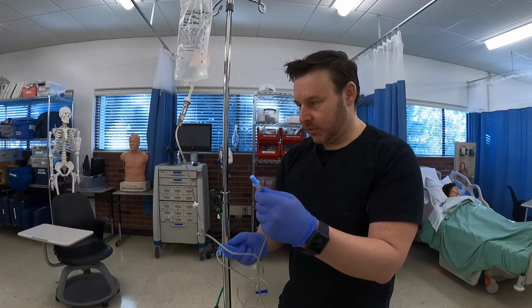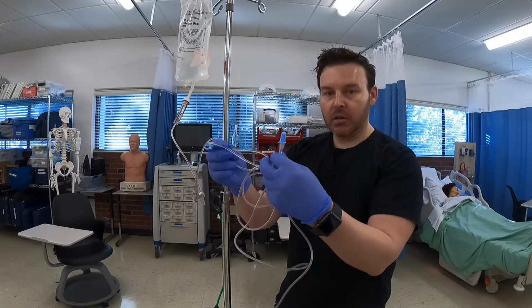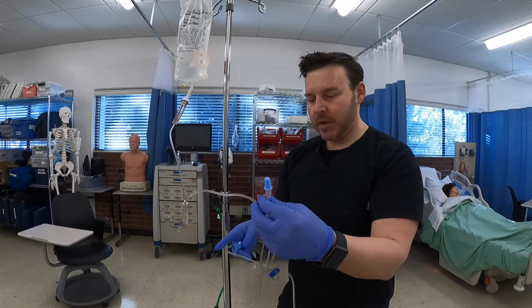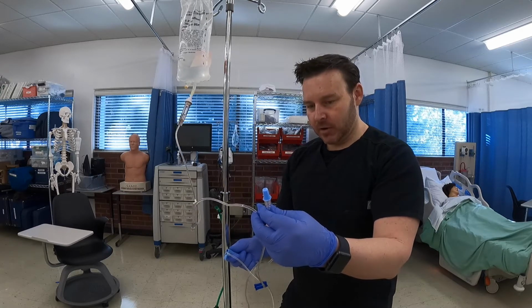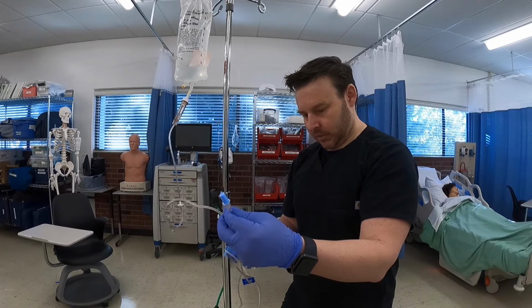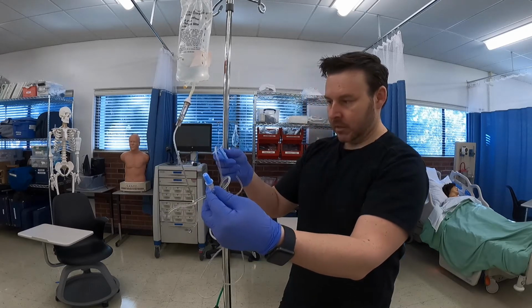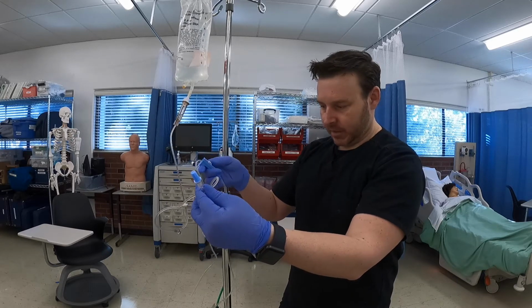And what you're doing is you're looking for the last little air bubble in the tubing, and you're just going to follow, which is right here at this present moment. And we're just going to follow that air bubble down to make sure that it gets eliminated through that blue tip. So it's making its way down right here. It's passing my clamp.